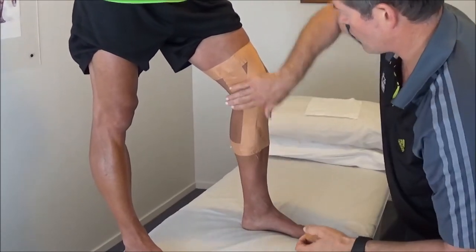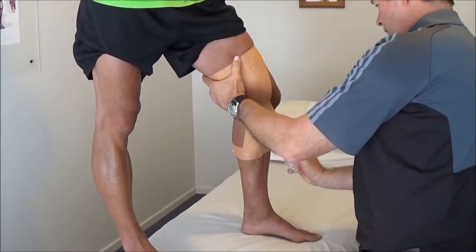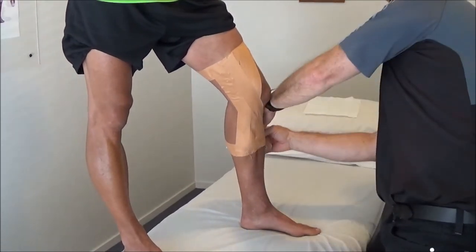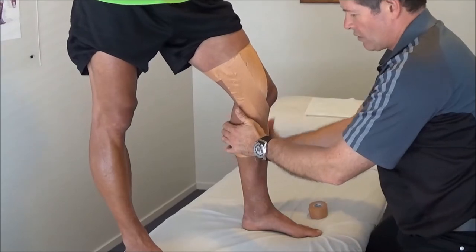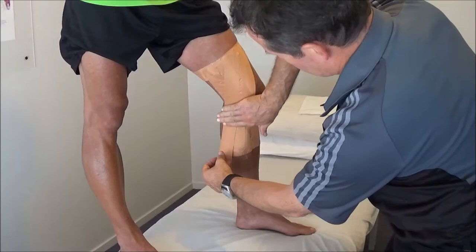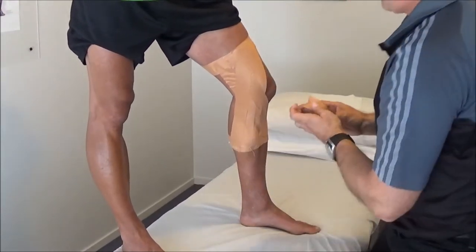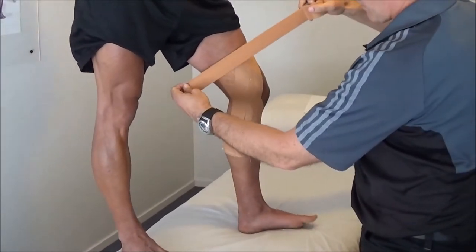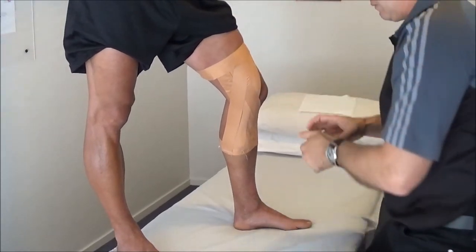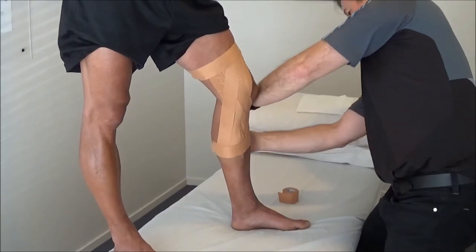As you're strapping down, just run your hand over it like I'm doing there and it just keeps the wrinkles out of it. Around the front of the leg here, and then one more down through here. So we're strapping here and then we come back, just do a little cap over the top.